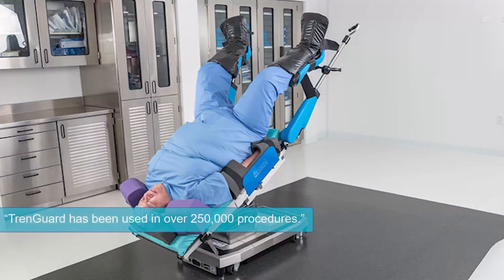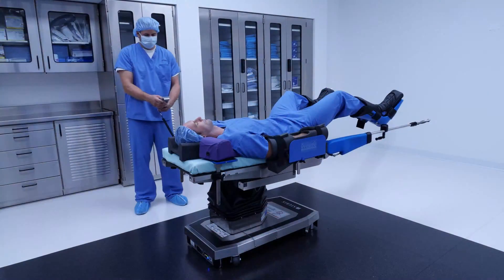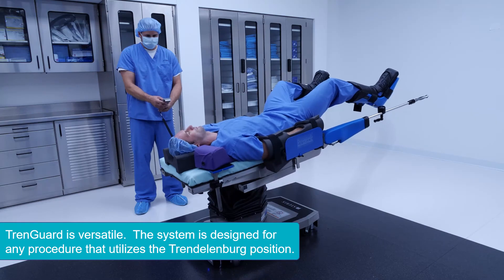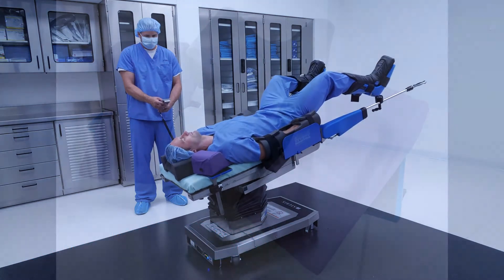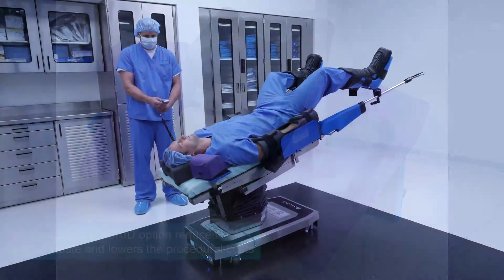TrendGuard has been used with over 250,000 procedures with no attributed patient sliding or post-operative pain. TrendGuard was designed for any surgical procedure that uses the Trendelenburg position. The hybrid system features reusable lateral stabilizing pillows to reduce the amount of medical waste and lower the cost per use.